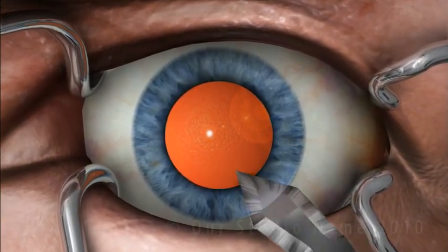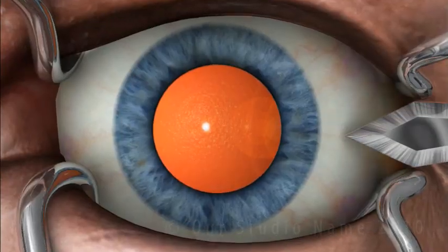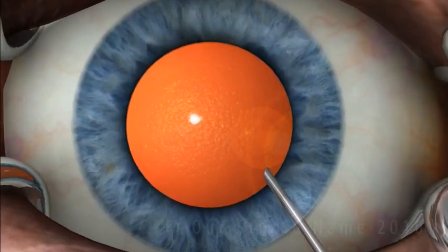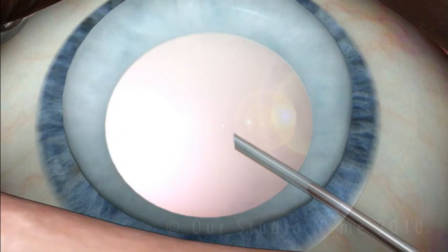Then, a small incision is made in the cornea of the eye. Fluids are injected into this incision to support the surrounding structures.